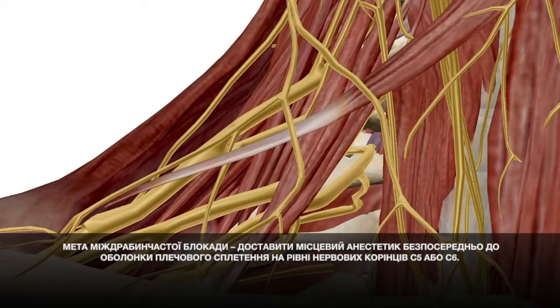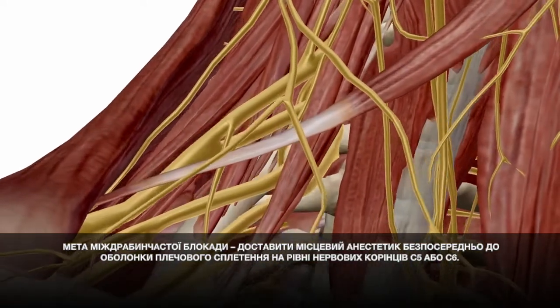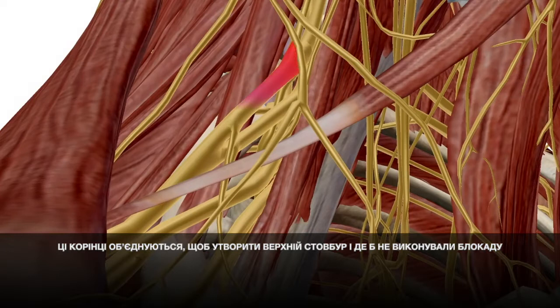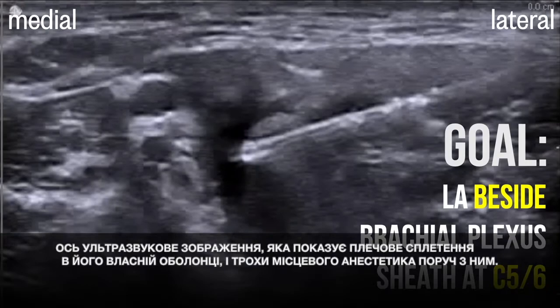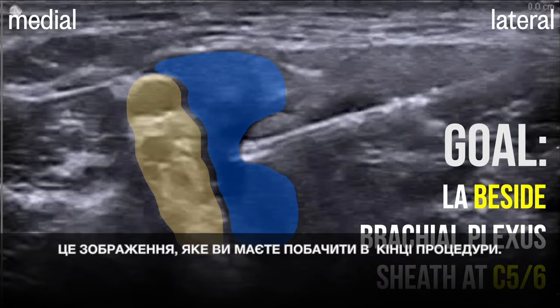The goal of the interscalene block is to place local anesthetic right next to the brachial plexus sheath at the level of the C5 and C6 nerve roots. These roots come together to form the superior trunk, and whether you do the block where they're single roots or one trunk doesn't seem to influence the clinical effect much. Here's an ultrasound image showing the brachial plexus contained within its sheath and a puddle of local anesthetic right beside it. This is the image you're aiming for at the end of the procedure.